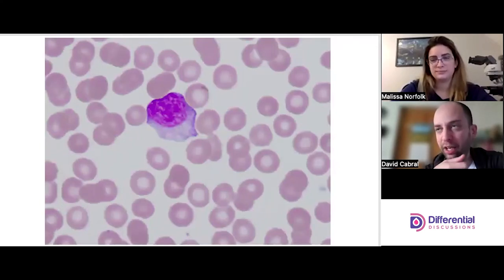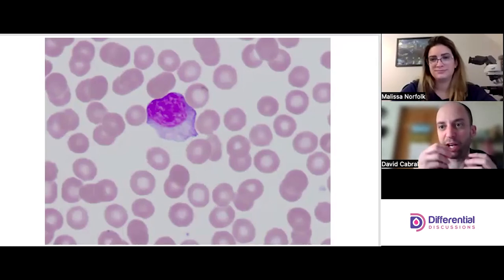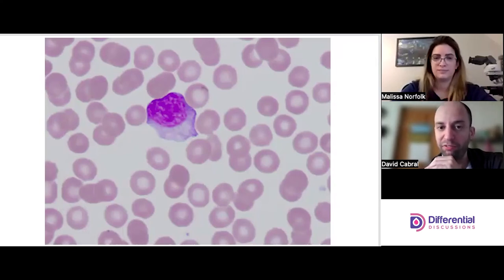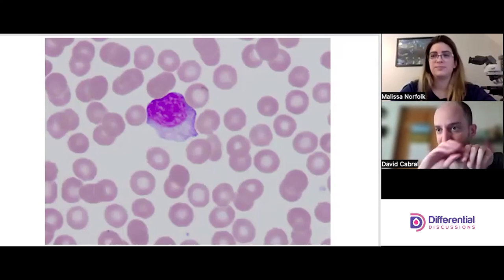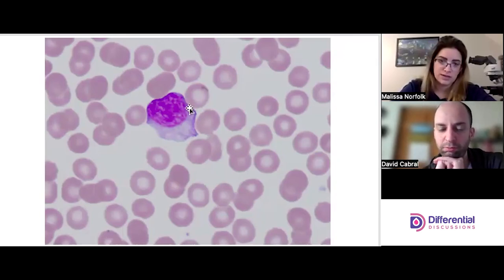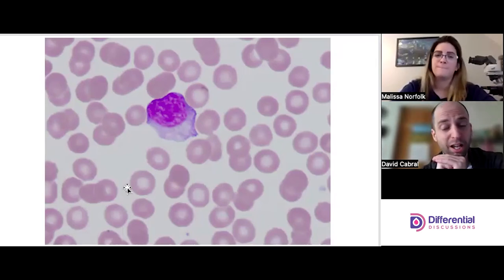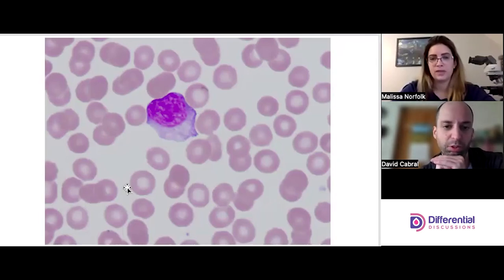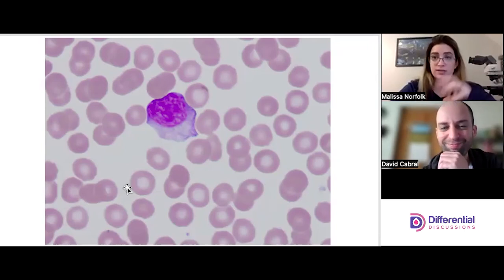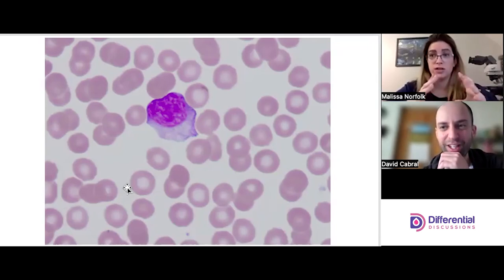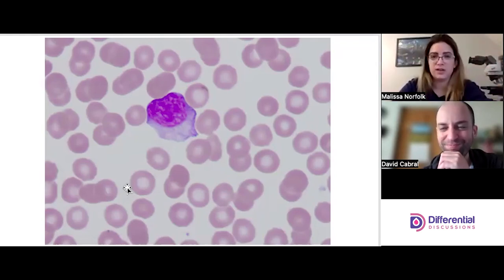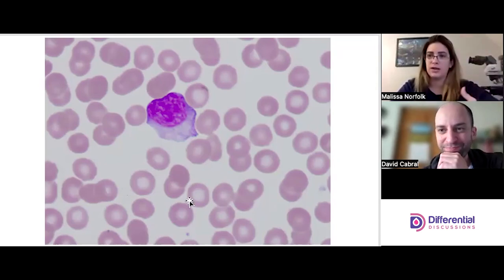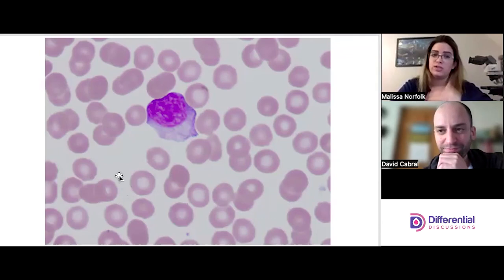This next cell has less of the stretchy, blaring-horn quality of the reactive lymph, but still a lot of great reactive lymph qualities — particularly the color. That deep dark blue here around this edge is just telltale, just screaming reactive lymph. The nucleus is still stretched; it's just not stretched as dramatically as some of the others. You can still see really prominent white striations throughout the nucleus even though it's not huge like the previous examples.